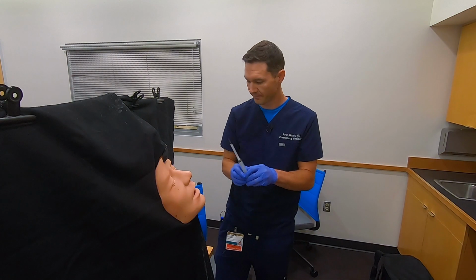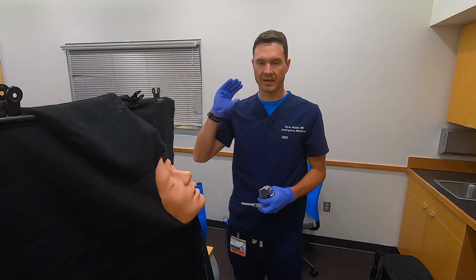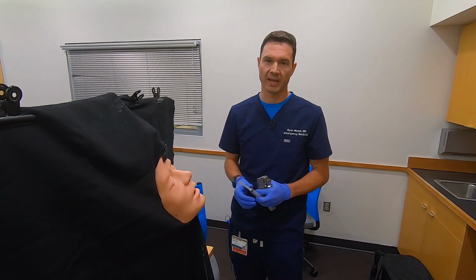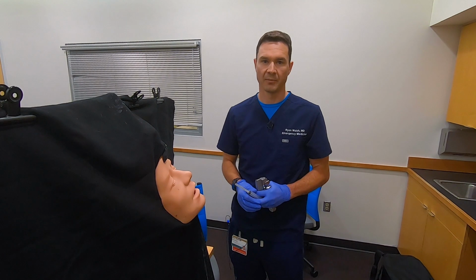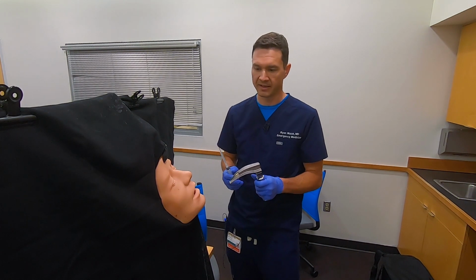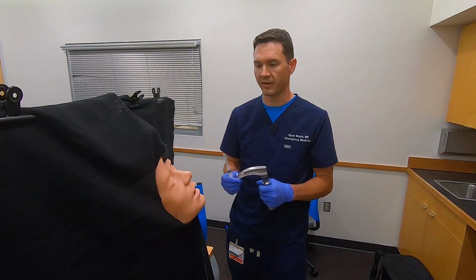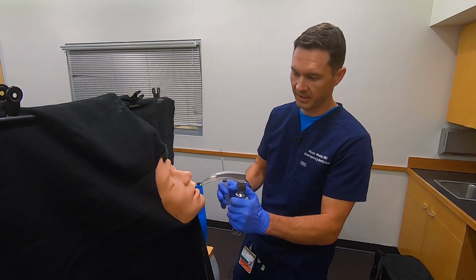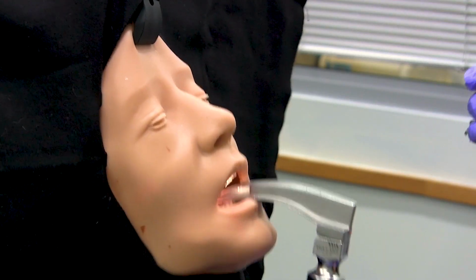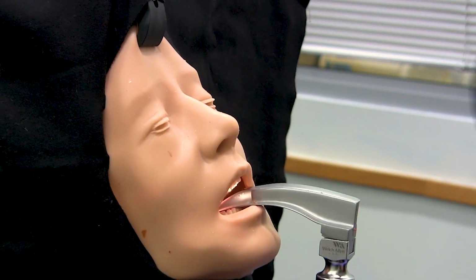up more space. So we like to have the patient upright with their head back up against usually a hospital bed. Want to make sure that we have suction available there. And we use a laryngoscope blade. Typically, I like to have the patient hold the laryngoscope blade, although sometimes people like to hold that themselves. We'll go ahead and hold the laryngoscope this way, putting the blade into the mouth, and then coming down in order to get the correct visualization.